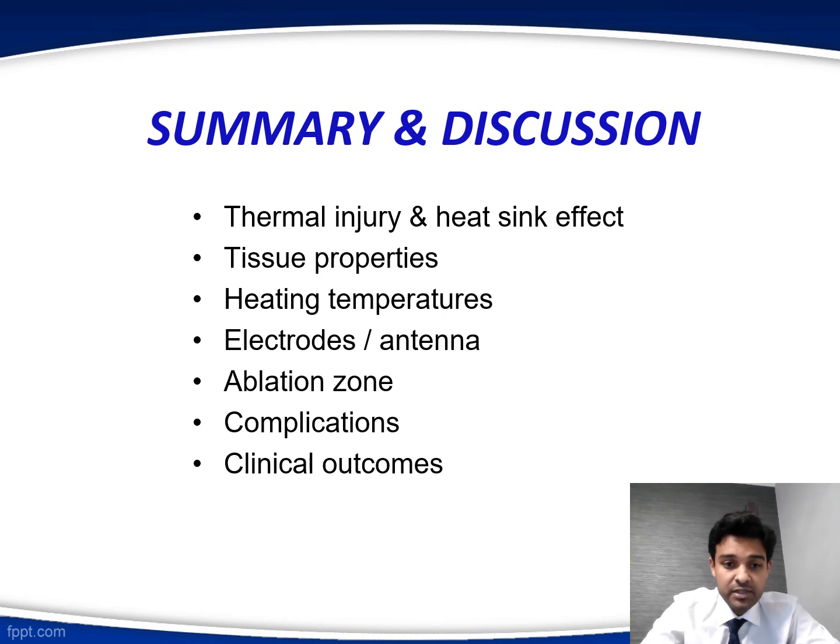Electrodes, there are 3 different types of electrodes we went through: monopolar, bipolar, and multipolar electrodes. The introduction of saline infusion pumps, and their use, and then the different attributes for a proper microwave antenna. Then the various ablation zones we have stressed upon, as in microwave ablation, as the power increases over the time, the different ablation zones.